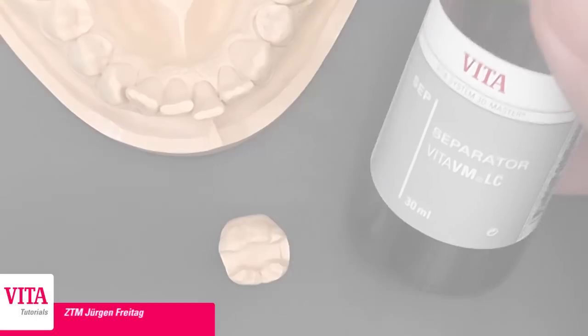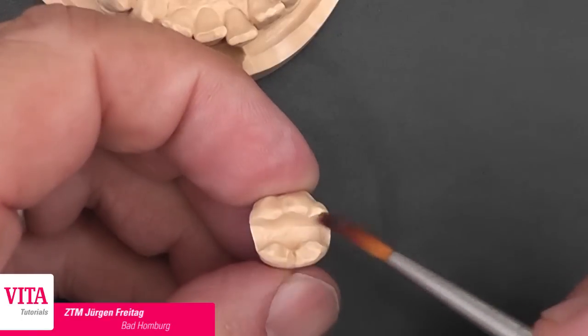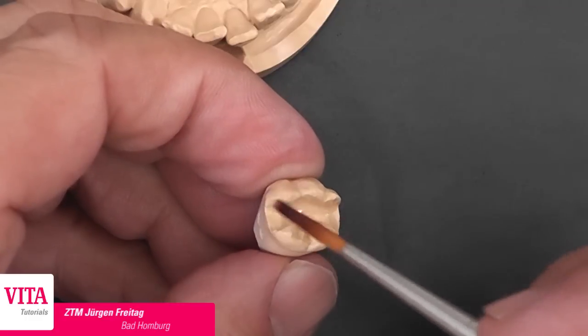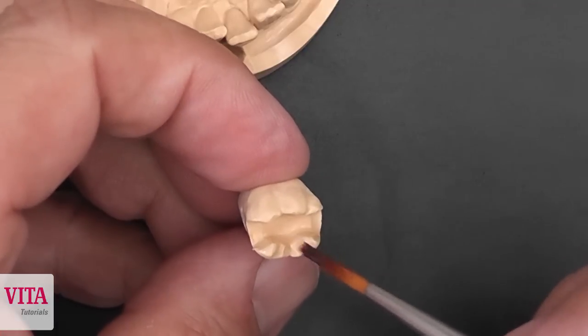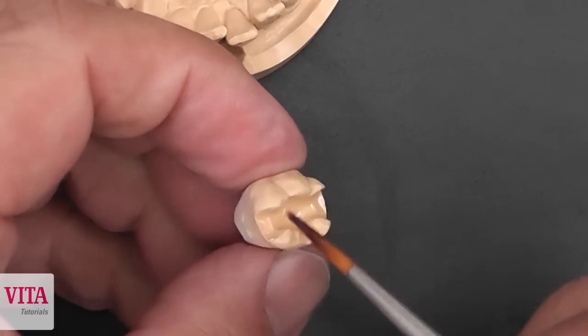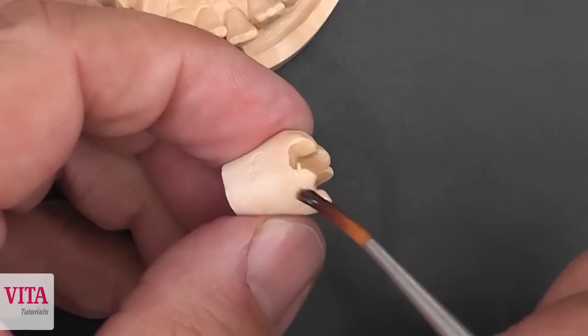The first step for the buildup of the inlay is to separate it. For this we use a Vita separator in a thin layer and let it dry for one or two minutes.